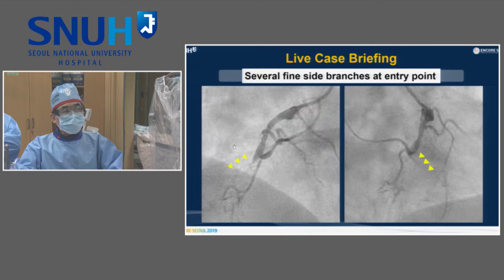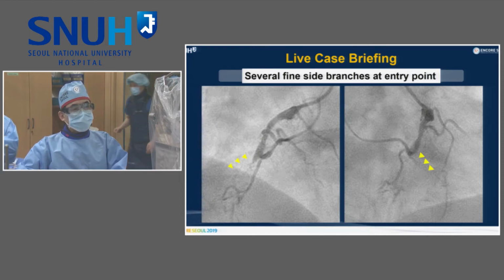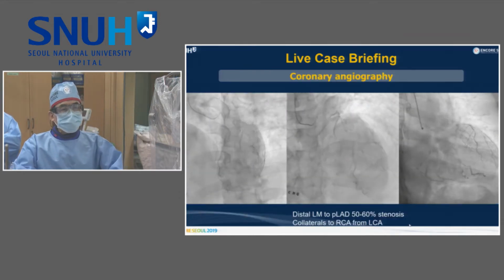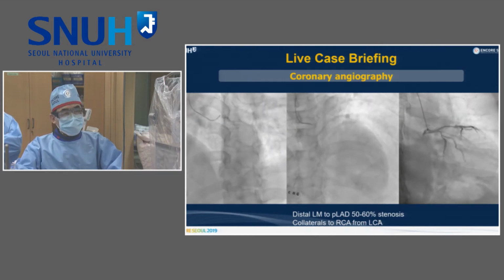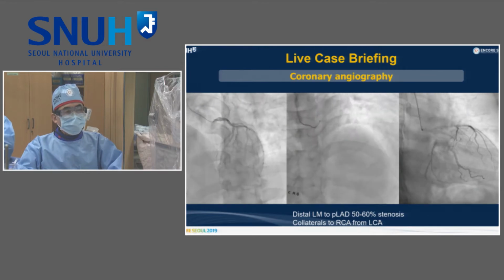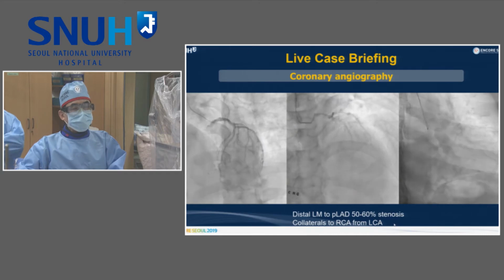That could be a factor that misleads the interventionist in another direction. This is the left angiogram, showing a few septal collateral channels to the RCA, but ipsilateral flow is good, thus the left coronary angiogram cannot show the full distal RCA.